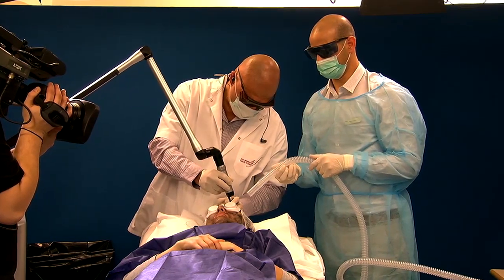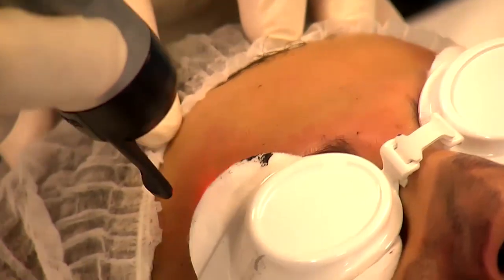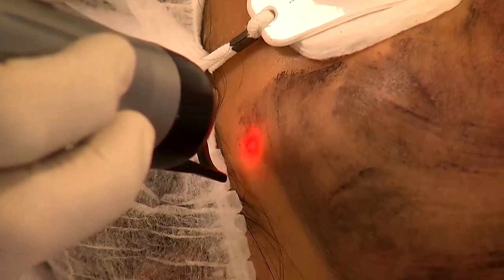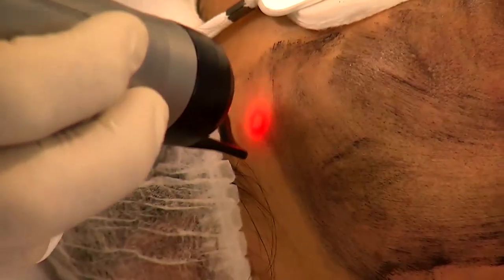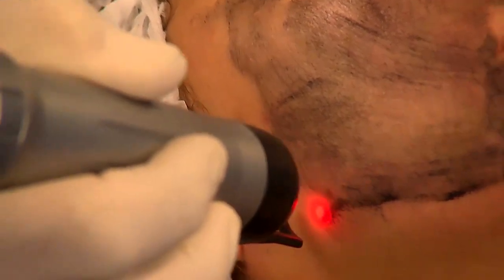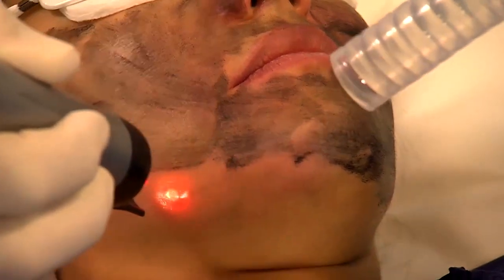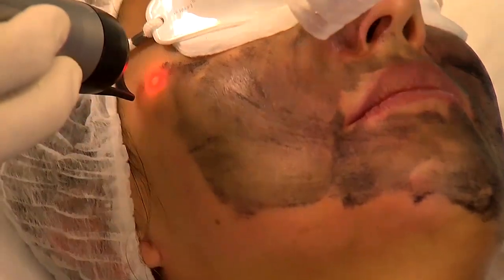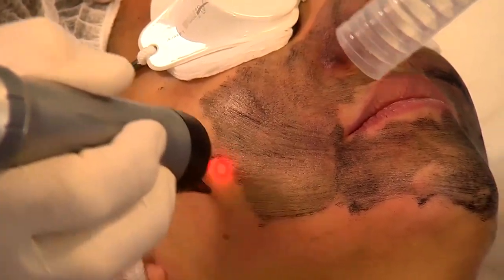And again, this is painless. We do want to clean out all the carbon. You can work from a little far away distance — you don't have to be on the skin with the handpiece — because it's the collimated handpiece, and so the energy does not disperse, and we don't lose any of it.